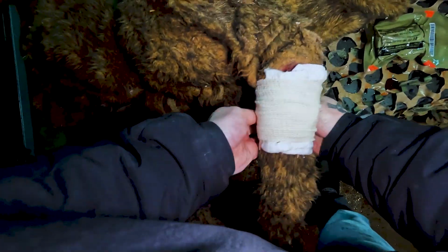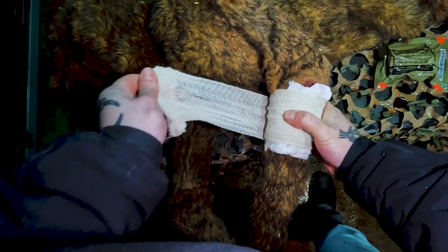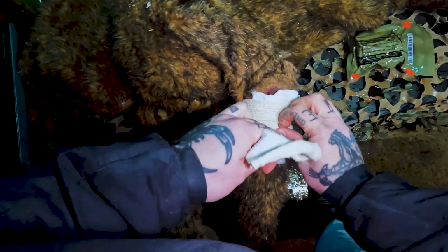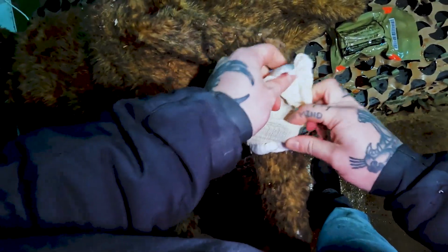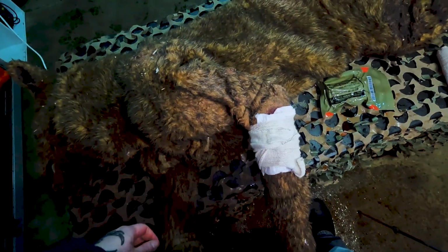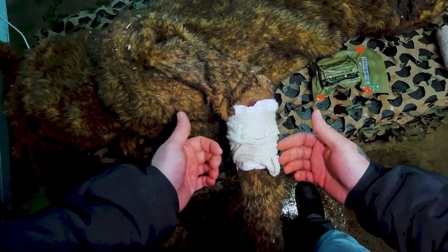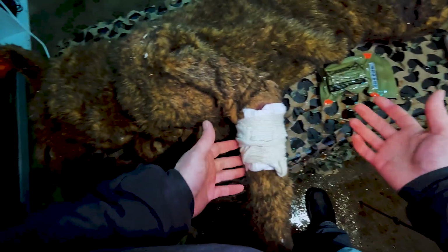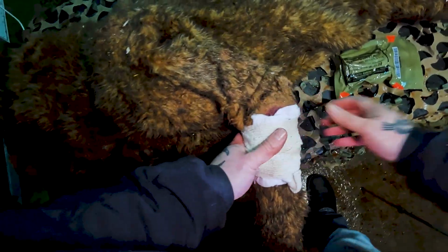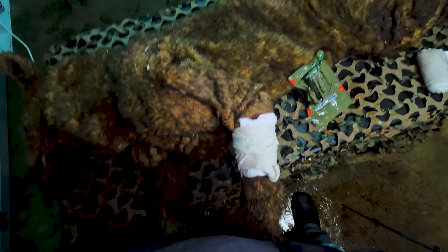This bandage has been reused a bunch. They normally have a plastic clip on the end that you can use to secure it on itself, or you can also tuck it like any of the other dressings. One thing: if the wound continues to bleed, it's called strike through. You don't necessarily take the bandaging material off. If you have strike through, put more bandaging material, like another dressing, on top of it and apply more pressure.